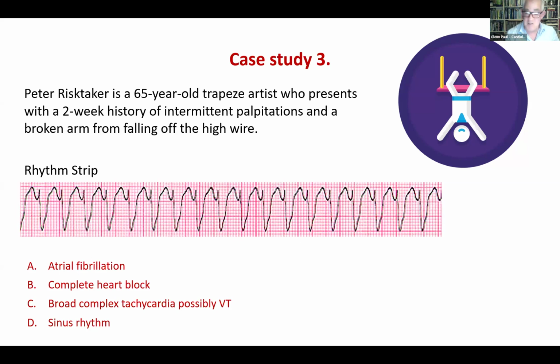If it's reassuring, there is no consistent pattern to how people do this, at St George. So just do your best as long as it's reasonable. If you want to put it on their legs, you can pop it on their legs. If you want to put it on their upper thigh, you can pop it on their upper thigh. The important thing is that you get a good trace, and that if you do repeated traces, you have consistency with placement, whether that be on the chest leads or the limb leads.